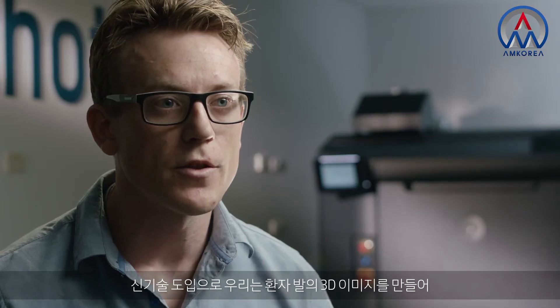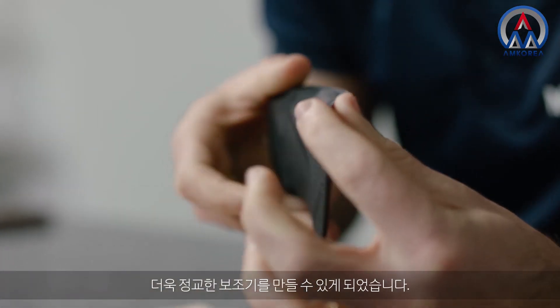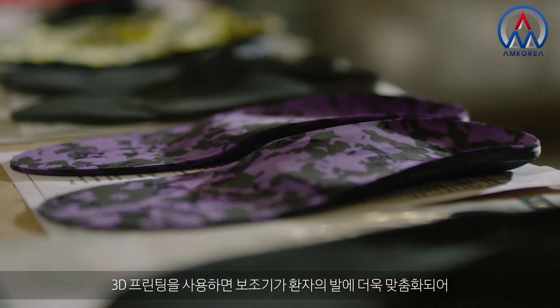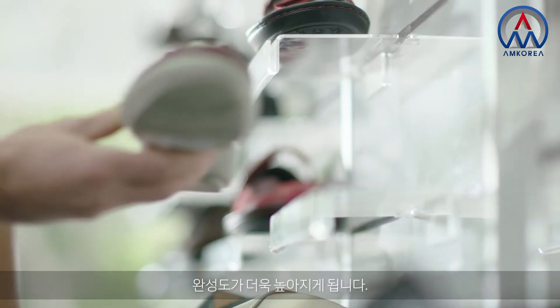The new technology in our industry allows us to take 3D images of patients' feet. It allows for a lot more accurate orthotics, and the 3D printing allows those devices to be far better matched to the patient's feet to give them better outcomes.